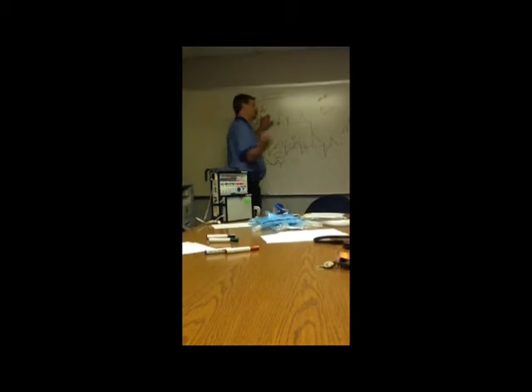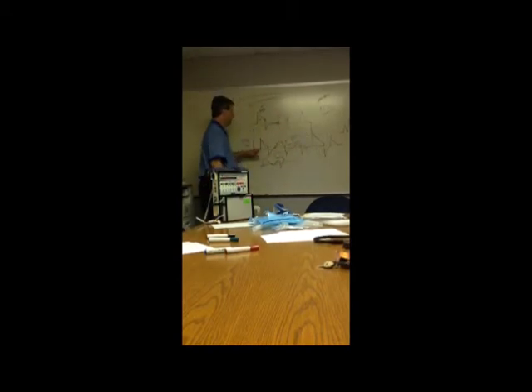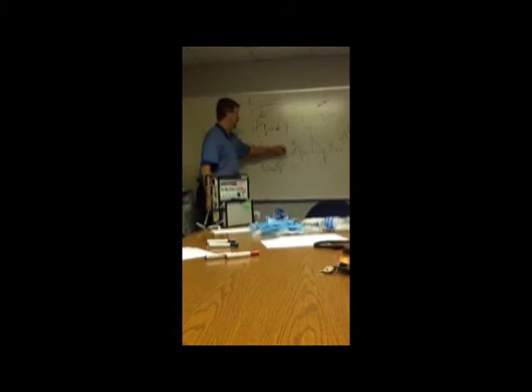All right, so those are the 3 breath patterns. That's what makes up almost every mode of ventilation. Assist control, it's taking all the work from the patient, whether we give them a breath on our terms or they start it on their own. We do everything from there. They have no work. IMV, they can start a breath. If they start a breath at the time the machine was going to give them one, they get a full breath. If in between they try to take breaths, it gives them very little help, more so if you have pressure support added or none if you don't, and they have to do the work on these.